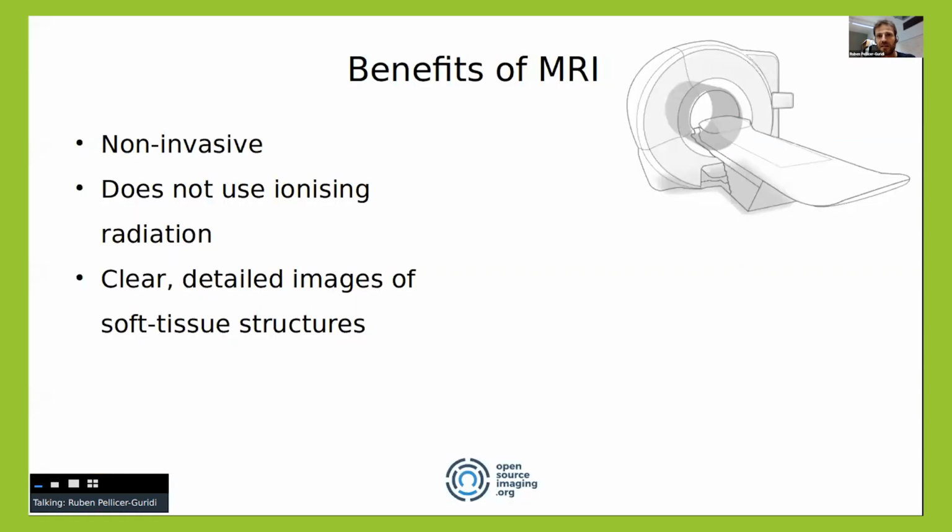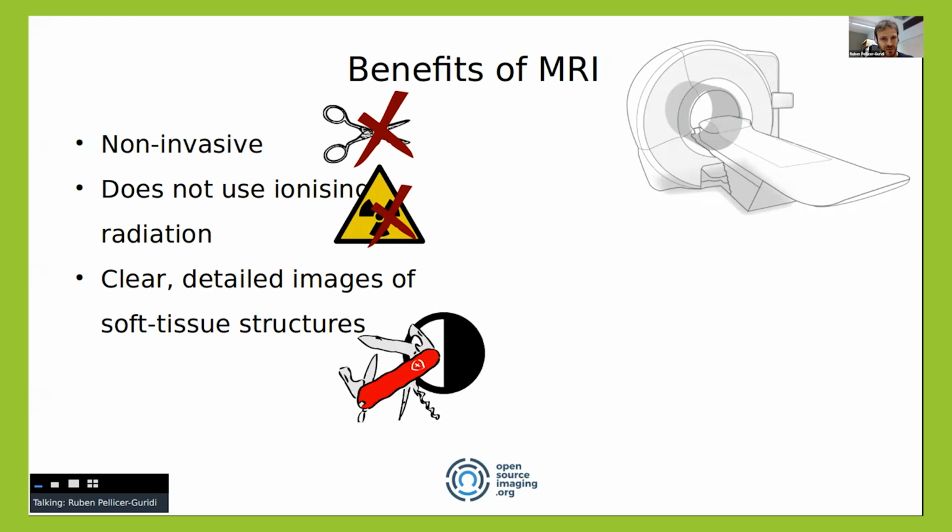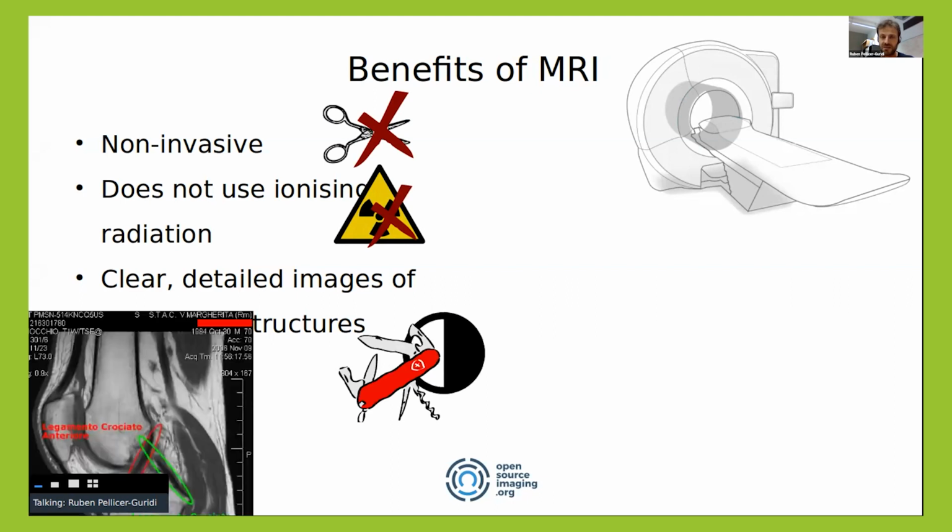In the first slide, we wanted to introduce the motivation for this community, why we feel the community is needed. And the thing is that MRI is a gold standard. It's very useful for many human clinical applications because it is non-invasive. You don't need to cut open the patient to look inside. It doesn't harm the patient. And it gives a lot of options for contrasts. For example, you can see cartilage on a knee injury. It is not that easy to see with other imaging technologies.